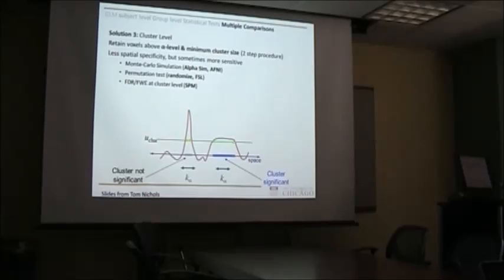So if it's just one voxel, I don't really think it's activation. I want to say, well, it should at least be 10 voxels. My activation pattern should at least be 10 voxels wide. And the reason to do it is because you're losing some spatial specificity, right? If your clusters become larger and larger, you're not really necessarily sure anymore whether it was some activation from this little nuclei in the brain or some other nuclei, but depending on how this activation is spread, you might be more sensitive to pick something up. In other words, you make less type 2 errors, you have more statistical power.